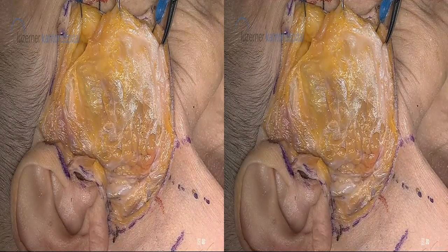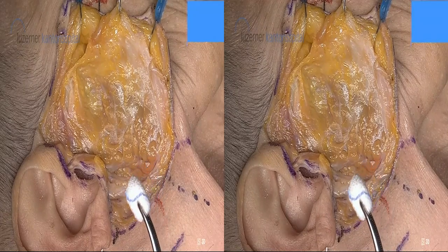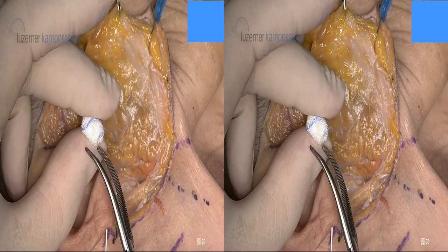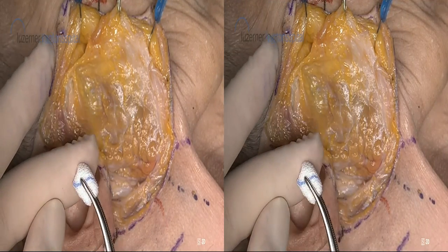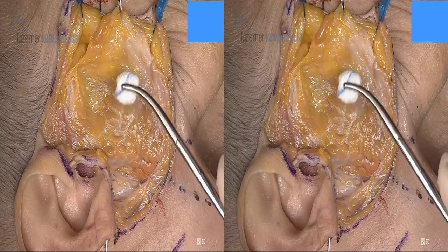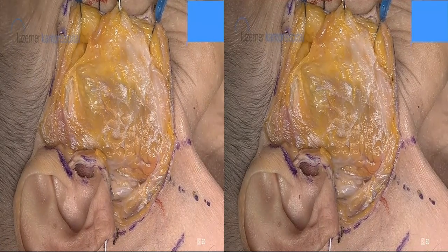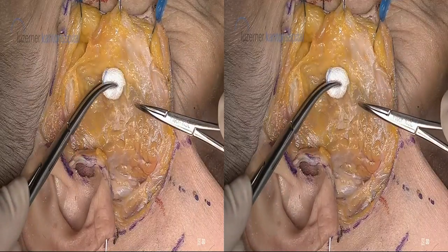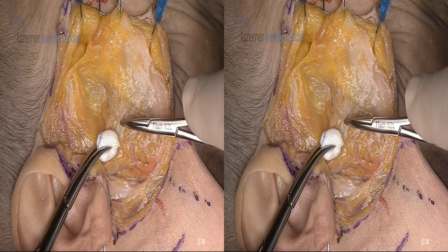I like to use some peanuts. Now the nurses may give you this clamp like this — but this you cannot use because it's very floppy and you cannot dissect. So you have to ask your nurse to place it two-thirds into the clamp — two-thirds in, one-third is out — and this is now very stable. It will not move around and you can easily dissect and at the same time control the bleeders. But make sure the nurse has given you the peanut in this way. So we have on the left side the peanut, and on the right hand, as a right-handed surgeon, we are now looking for peripheral facial nerve branches within the parotid gland.